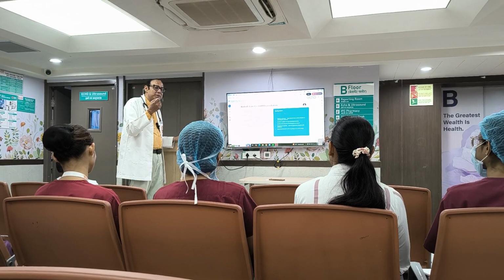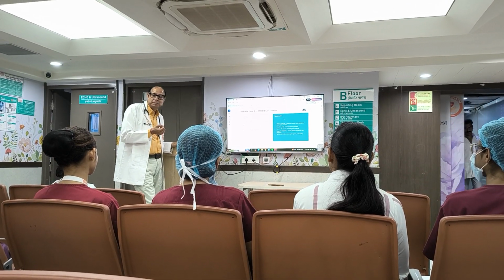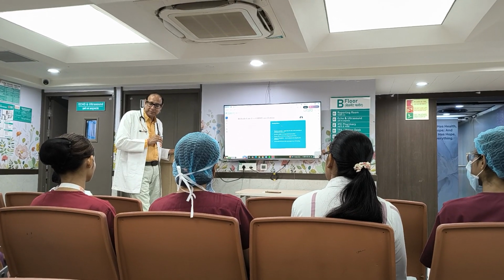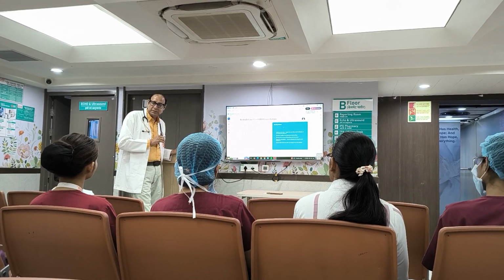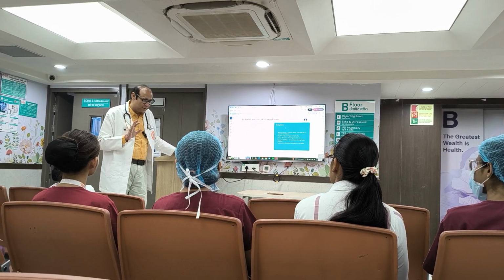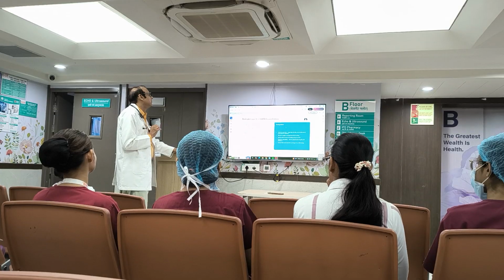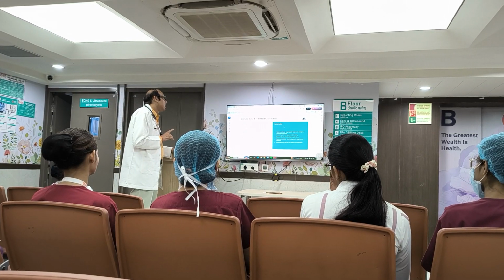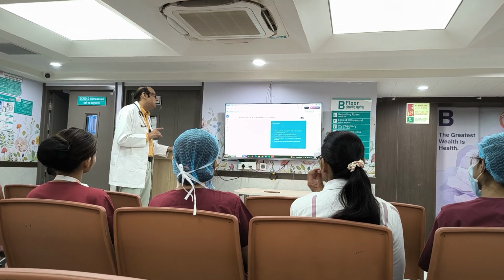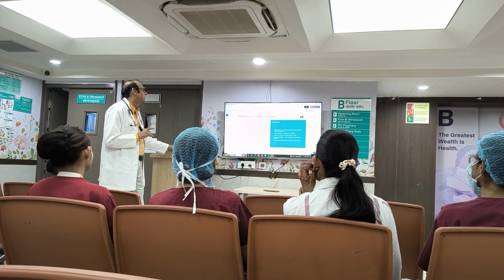नेजल कैनुला हाउ मच ऑक्सीजन प्रोवाइड करता है? नेजल कैनुला के थ्रू हम कितना ऑक्सीजन दे सकते हैं? 1 to लेस देन 6 तक थे. हाँ, राइट. ठीक है, उसका PH 7.30, PCO2 68, bicarb is 32 and PaO2 is 58.